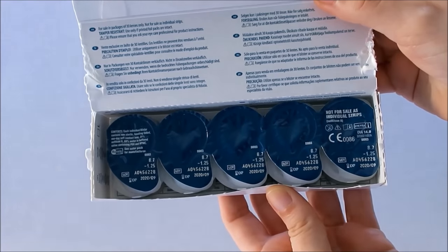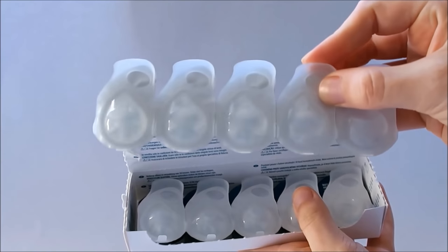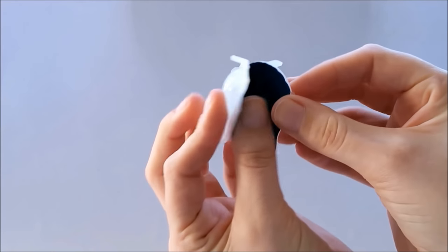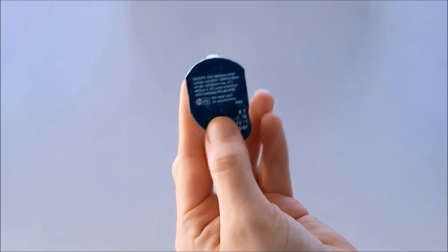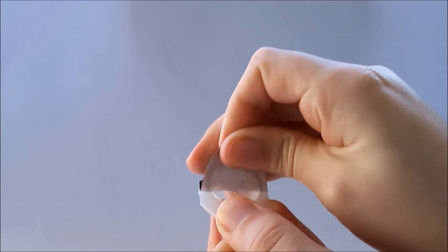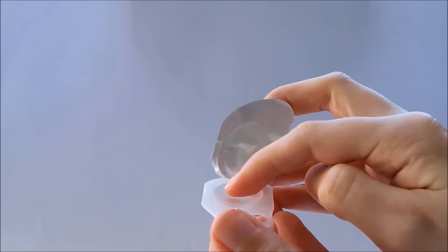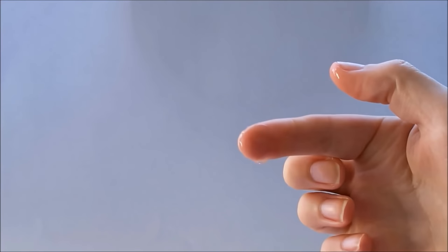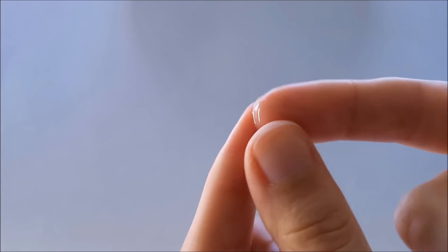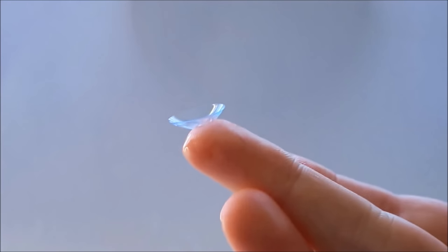Clear dailies are great because they require the least amount of effort and hygiene. You don't need to clean them and you get a fresh pair every time you wear them. This makes them more on the expensive side — for my clear ones I pay about $1 per lens. They come in blister packs which is very hygienic and you don't need to prepare anything. All you need to do is make sure your hands are super clean, open up your blister pack and grab your contact lens. Since these are daily disposables they are a lot thinner than your monthlies or yearly lenses, and it can be quite hard to tell which is the right and wrong way, especially with dailies because they are so soft.